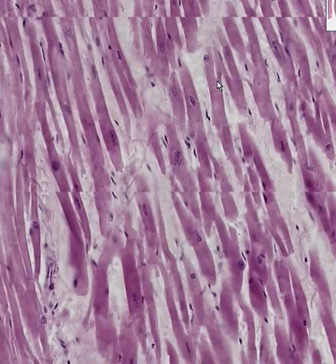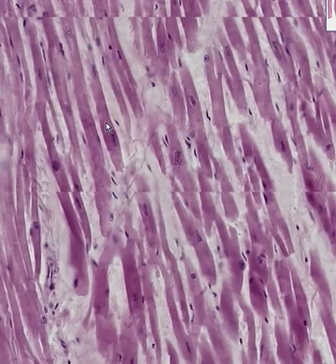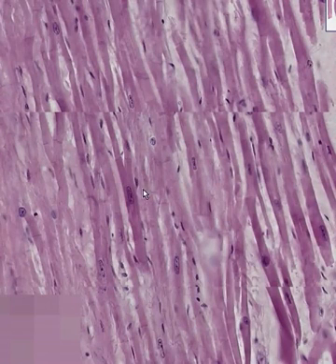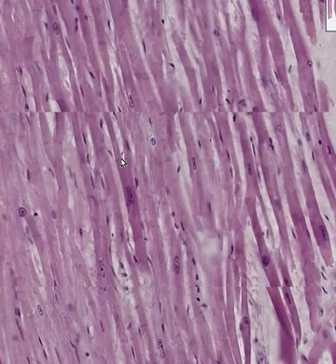They branch. And thirdly, you have an abundance of areas in which you could see little lines in the middle of two connecting fibers, like certainly here. And these are your intercalated discs.